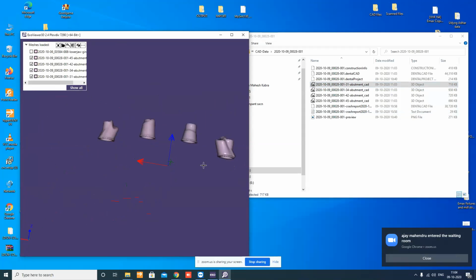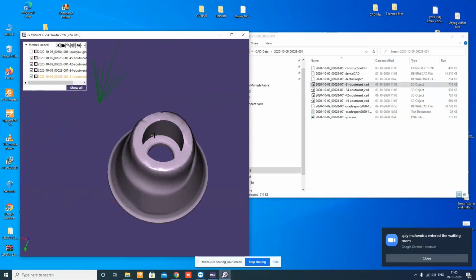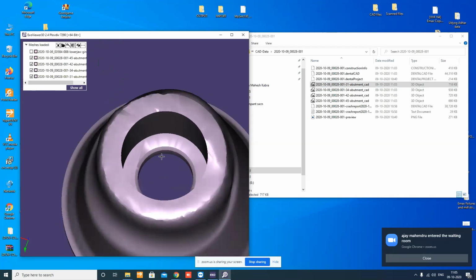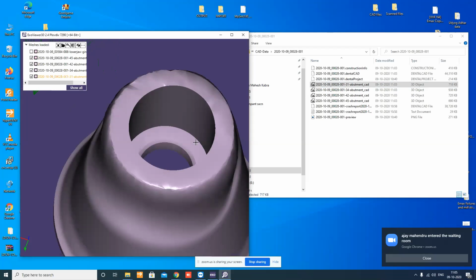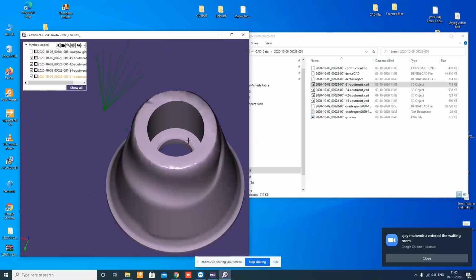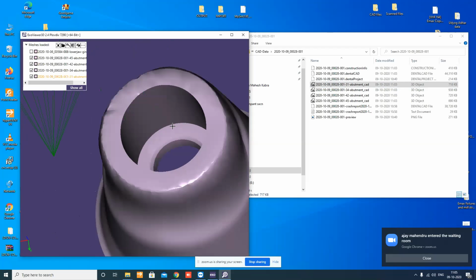So this is a connection surface, and the screw fitting area, screw head. This is what I was talking about yesterday, that if you zoom in, you see the screw fit area with perfect right angles as per the CAD design. So many times with the print, unless the print is too accurate, you may end up with this curved area.